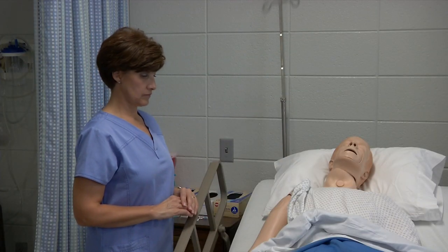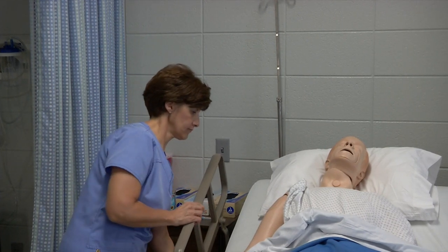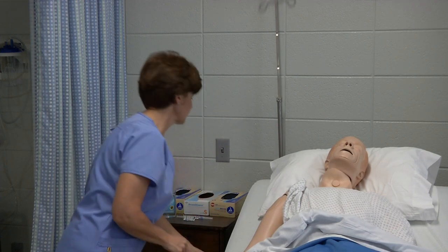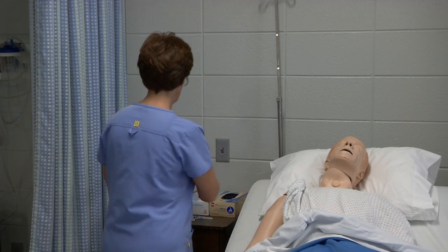Now you will be injecting the Toradol into the deltoid of the patient. So you're going to have the patient in the correct position. You're going to wash your hands and apply gloves.